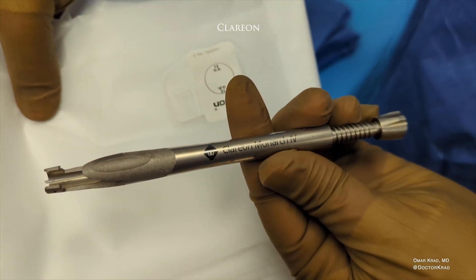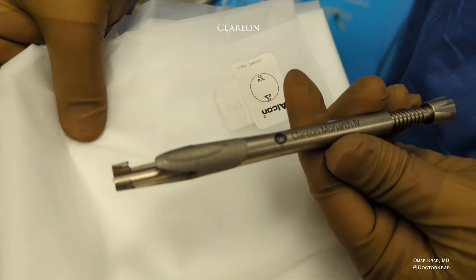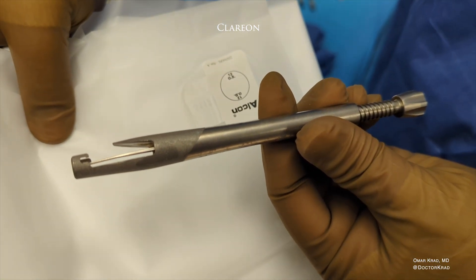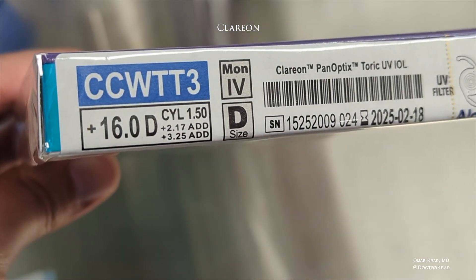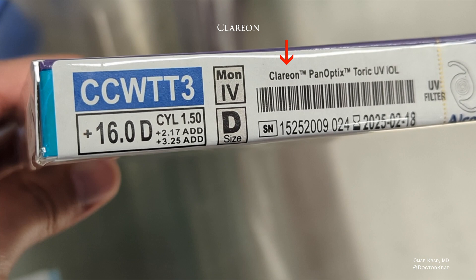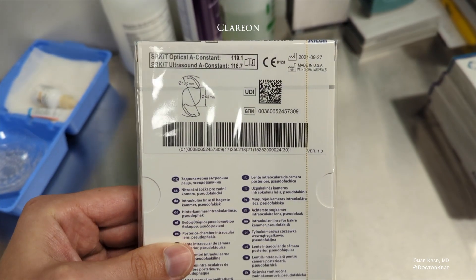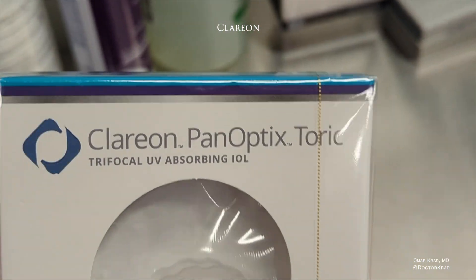Don't get me wrong — Alcon makes some amazing lens implants like their Toric lens implants, the Panoptix, and the Vivity. That's all the more reason why eye surgeons like myself could not wait for Alcon to improve their lens material. And here we are finally with new lens material to resist glistenings — it's called Clareon.